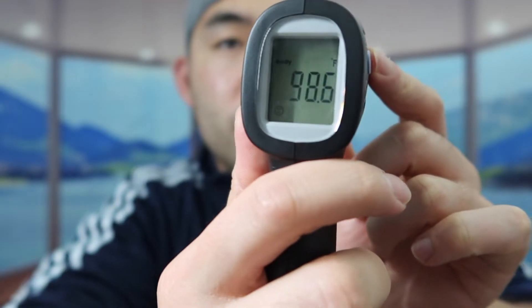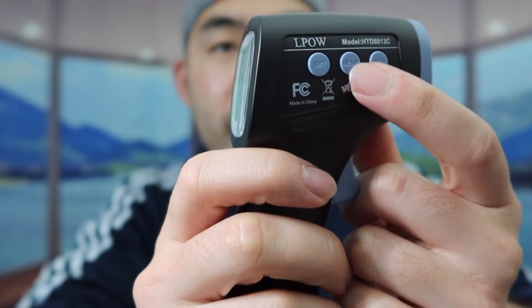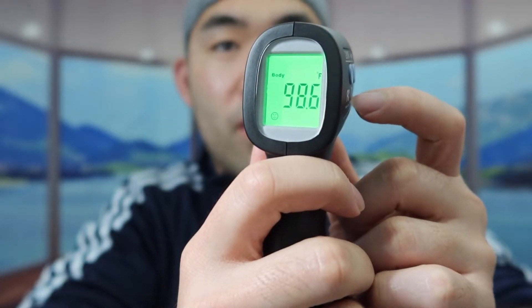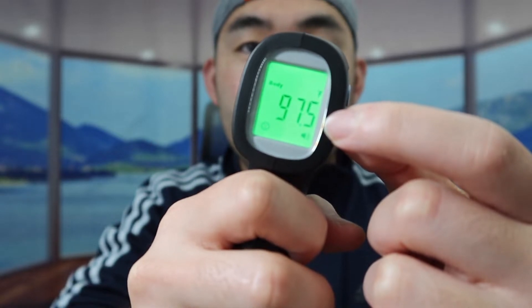So if you press on mode, you can change from body to surface. The second button is the memory button, and the first button turns the set option on and off. So if you try it on yourself — see how fast it gives you the result. Currently it's showing that I'm 97.5°F, so I am normal. The product definitely does work when you use it on yourself.